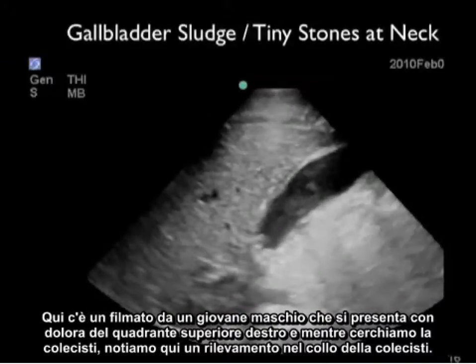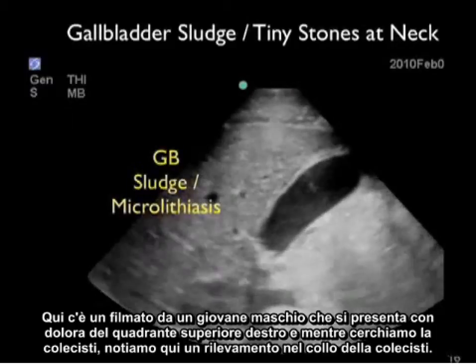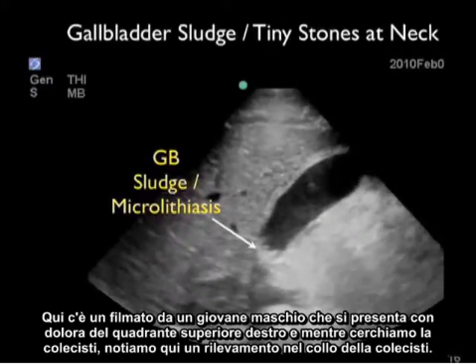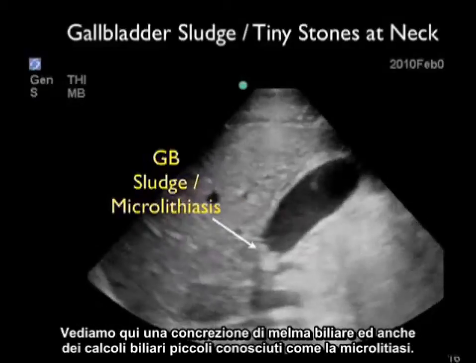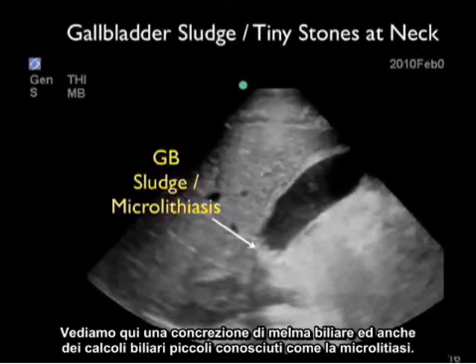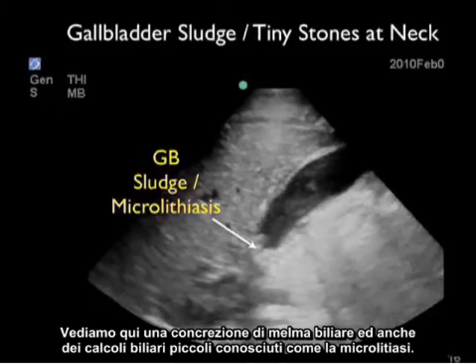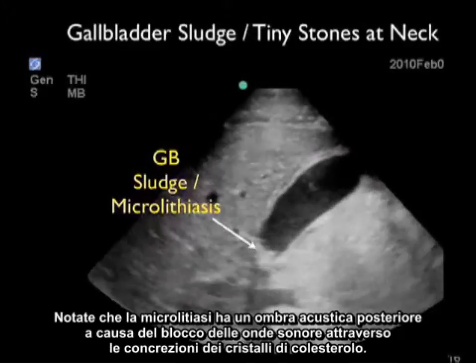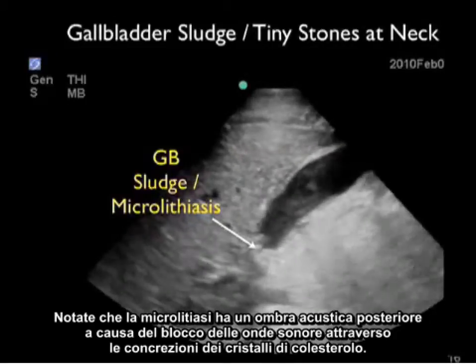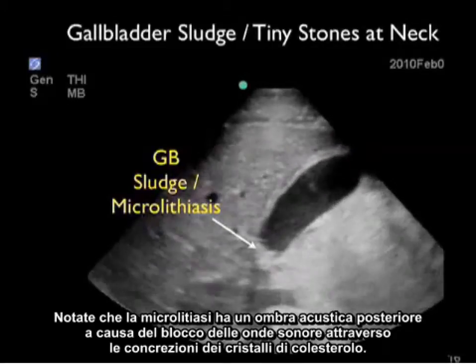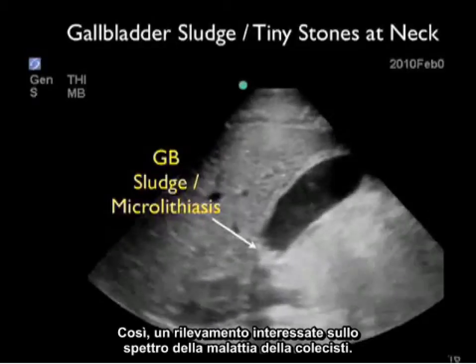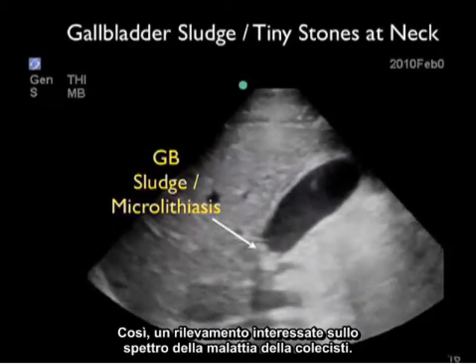Here's a video clip from a young male presenting with right upper quadrant pain. As we look through the gallbladder, we notice a finding within the neck: a concretion of gallbladder sludge and also tiny gallbladder stones known as microlithiasis. Notice that the microlithiasis has posterior acoustic shadowing due to the blocking of sound waves through the concretions of cholesterol crystals — an interesting finding on the spectrum of gallbladder disease.